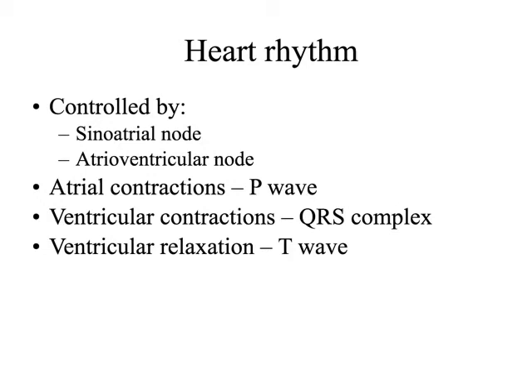But depending on the scanner manufacturer, I'm going to tell it, here's where that was, here's where that was, right? Then the software is going to calibrate itself to scan based on that. It's going to make just some time measurements, right? So it's not really technically gating. It's not actually waiting for the heart to initiate before it starts the scan. Because if I was triggering the actual scan off of the heart, there would be no way to actually tell the computer to do all of that complicated stuff. So rather, what I'm going to do is initiate a scanning timing protocol. And that timing protocol is based on some distance.